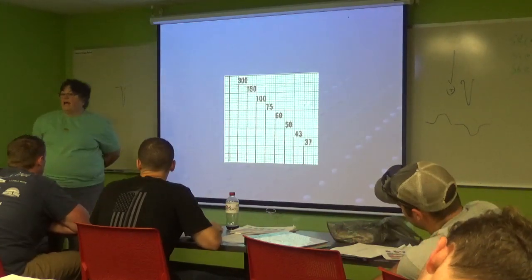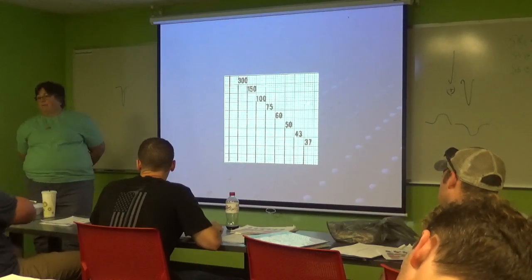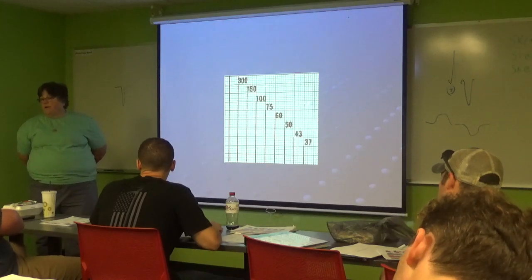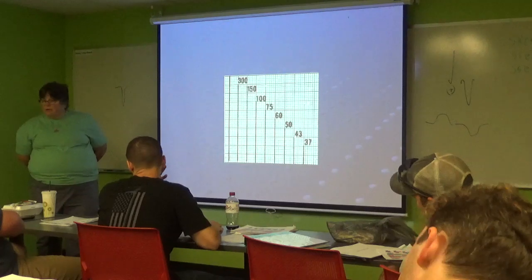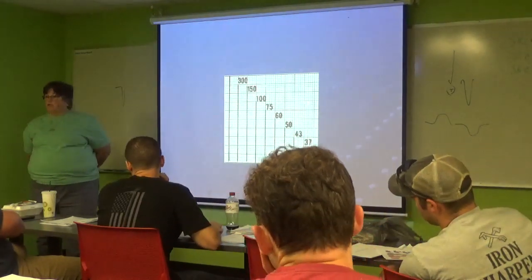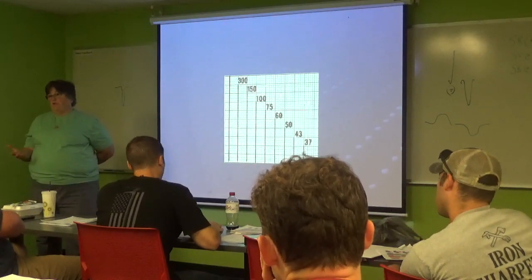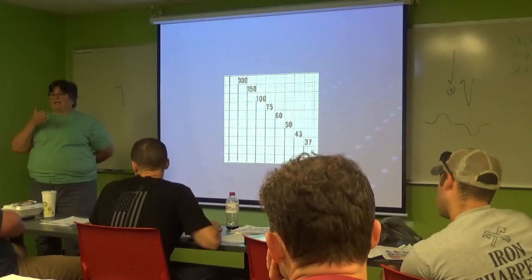When they say, I have ST elevation of V1, V2, V3, blah, blah, blah, the first thing I ask when I'm on the radio is, does the patient have a left bundle? And they say yes. And then I say, okay, we'll see when you get here. Because what they're seeing is a natural change in the EKG because of a left bundle, and they didn't recognize that. You're going to recognize that. And that's why you have to do intervals at this place.